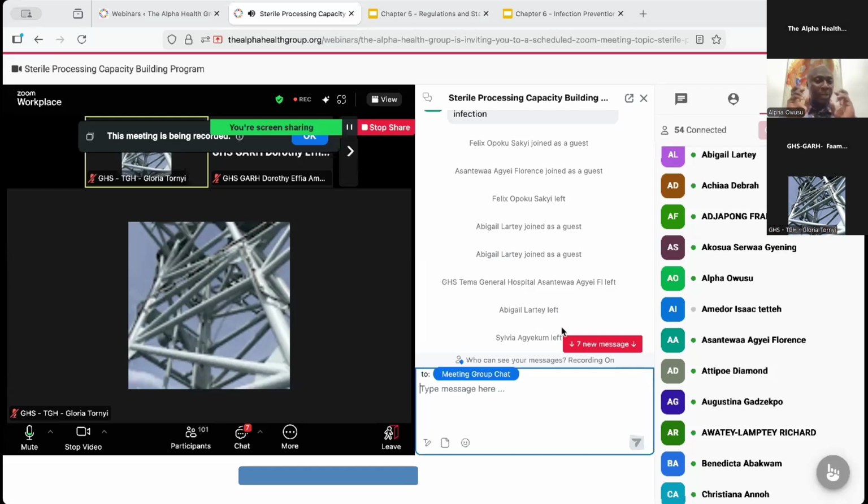So there's going to be a question at the end of your class: where does decontamination start, or where does cleaning start? It starts at point of use. So you do point of use cleaning, you spray, you reduce cross contamination.